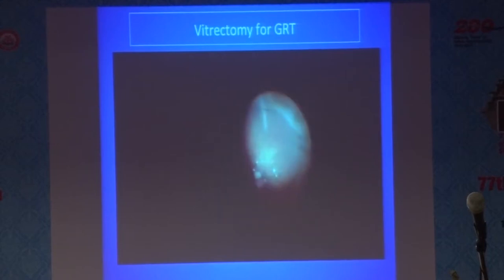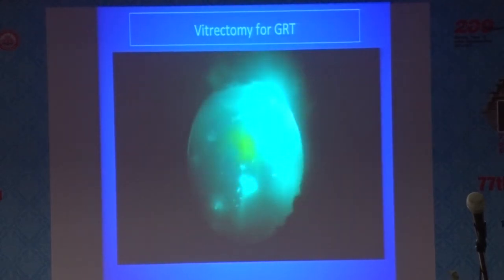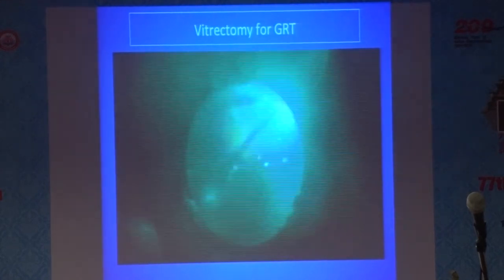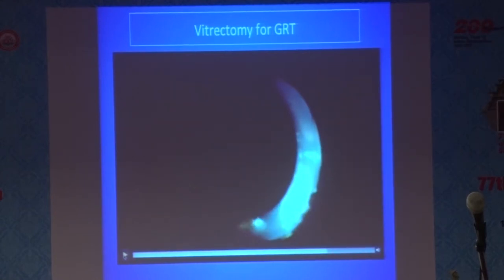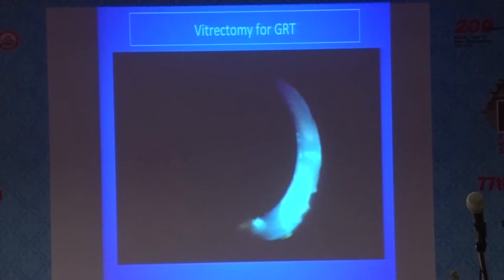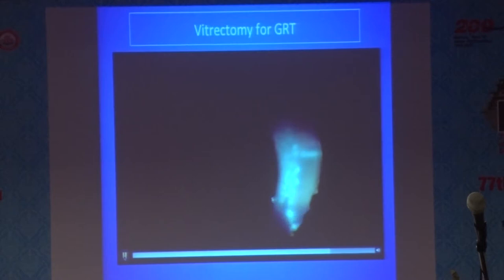You go all the way until you reach the anterior flap. The PFCL will act as a third hand, stabilizing the retina so you can complete peripheral vitreous dissection and trim the anterior flap of the giant retinal tear. After this, you perform endolaser. Then comes the next step — the question of whether you do a direct PFCL-to-oil exchange, which is the most common trend, or a PFCL-to-air exchange. The technique I will show, learned from Professor Dogra, is the PFCL-to-air exchange.